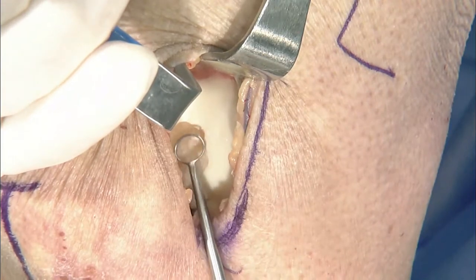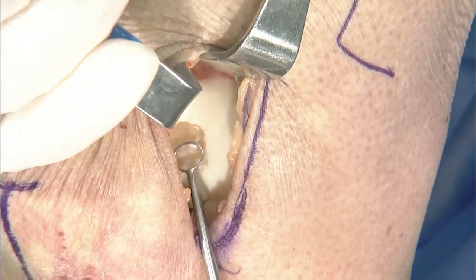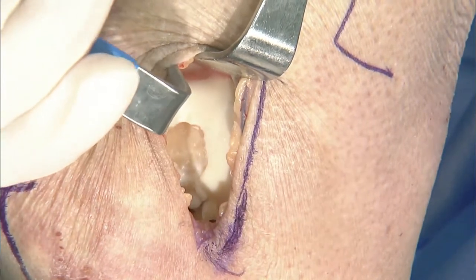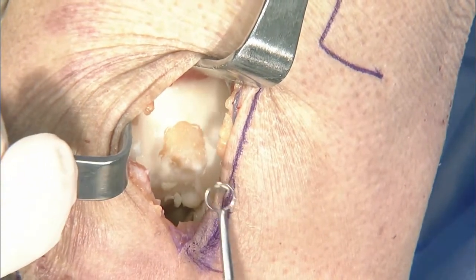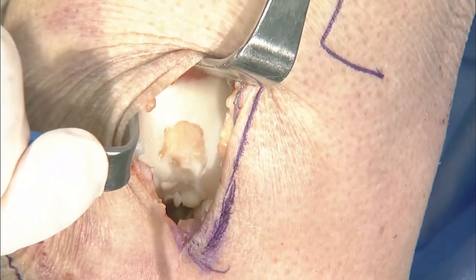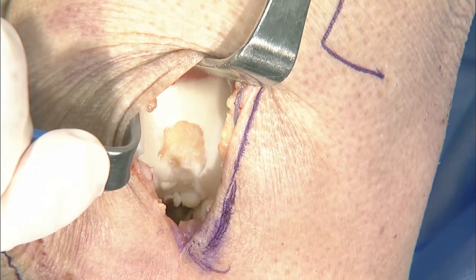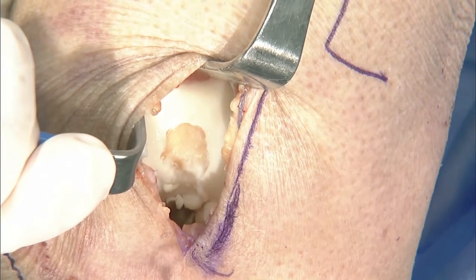Yeah, so now getting into removing that calcified cartilage layer and getting down to what's enough, it's a little bit tricky. I think there's a few different things that can help. One is the sound and the feel. It's like scraping sclerotic bone, basically. Once you're scraping sclerotic bone, you know that you're not quite deep enough yet. The other thing that you look at is some of that punctate bleeding in the bone. Once you're starting to get to that punctate bleeding, that's probably far enough. You don't need to go a lot farther.